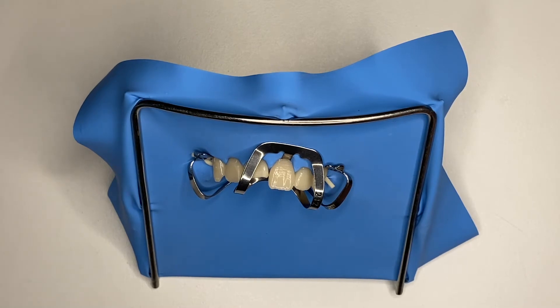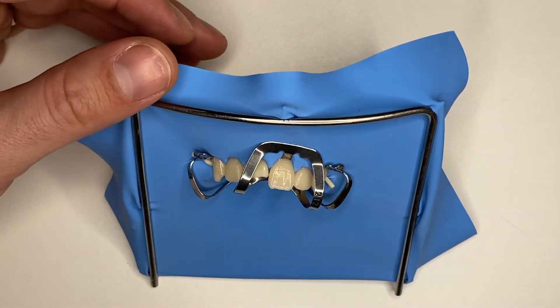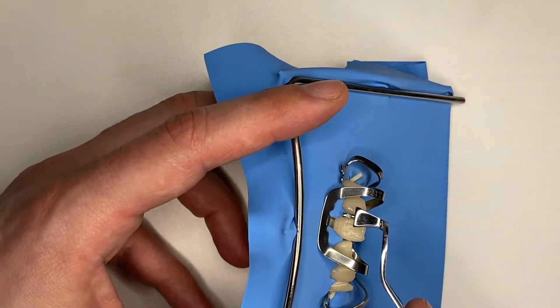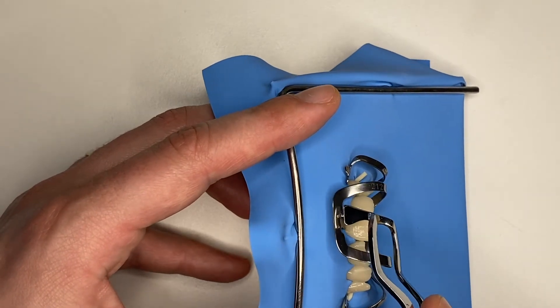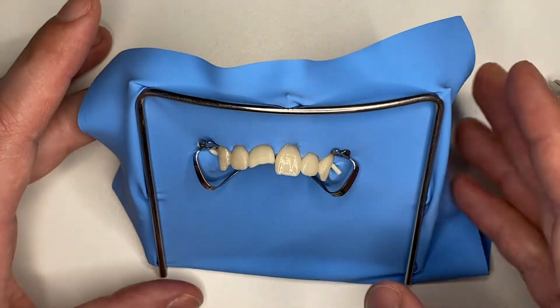As I said previously, if you're going to try to restore tooth number 1.1, you're not going to be able to use a clamp. The reason is that you'll probably have a silicone guide which is not going to fit on your dental field. As you can see, I've removed 212, and now I'm going to use this lasso.